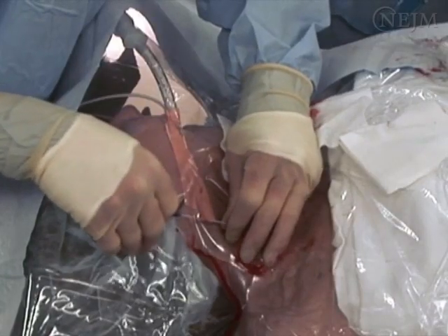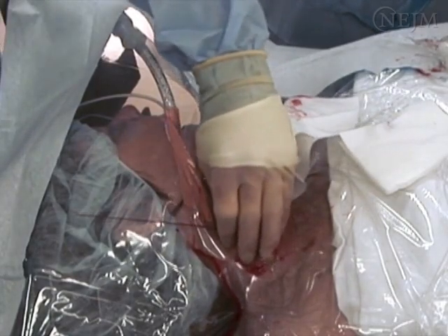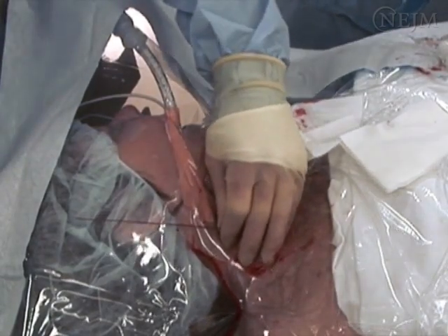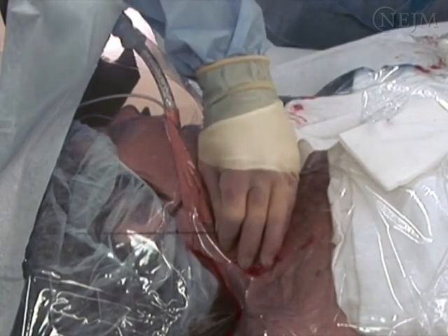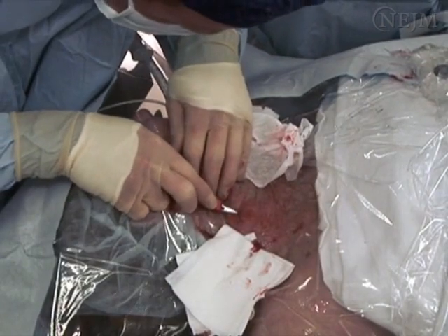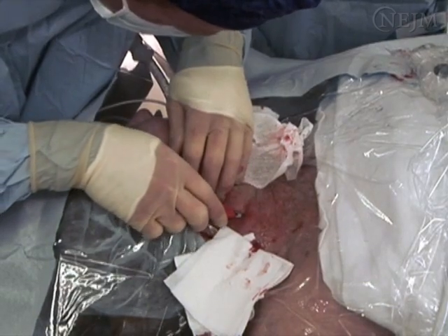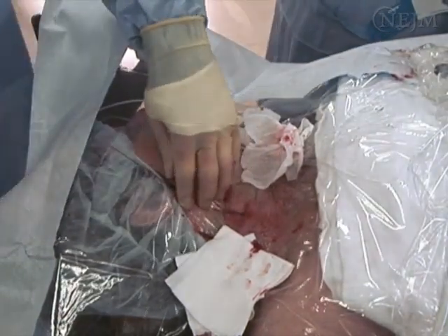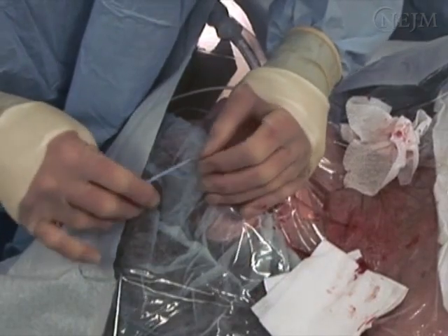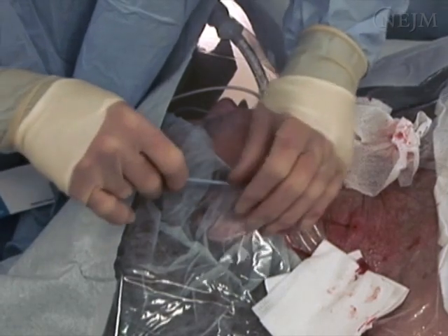After the guide wire has been inserted, withdraw the needle, leaving the guide wire in place. As the needle exits the skin, be sure to grasp the guide wire at the skin. At this point, only the wire remains in place. Using an 11-blade scalpel, make a small superficial incision at the entry point of the wire to facilitate passage of the dilator through the skin.